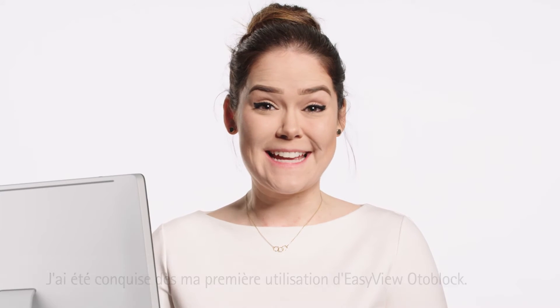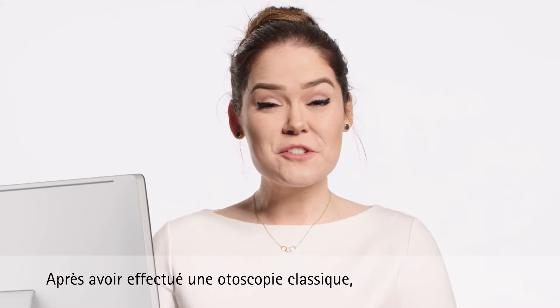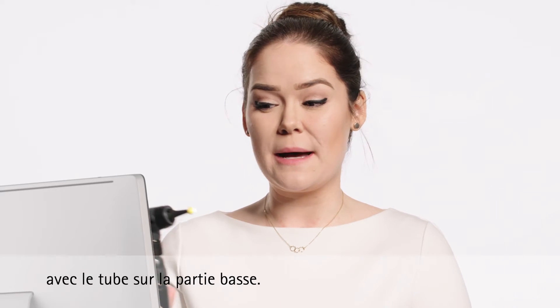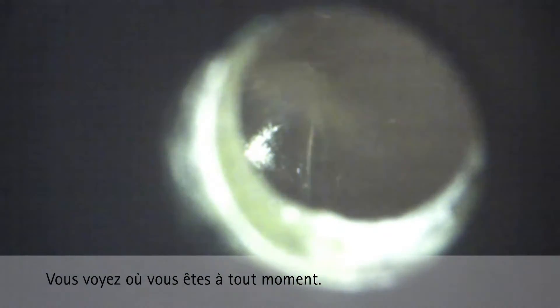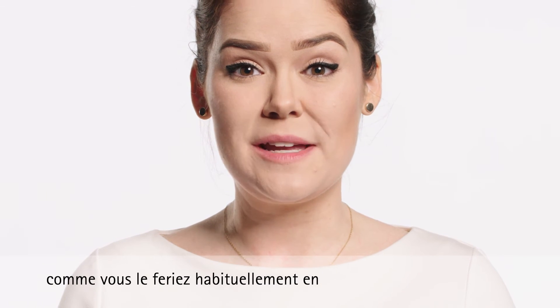The first time I used the EasyView Otoblock I was delighted — it's so simple. I can show you on my own ear. After conducting normal otoscopy, you place the EasyView Otoblock onto the specula with the tube along the bottom. Once it's on, you guide it all the way down the canal with a full view of where you are the entire time. At this point you proceed with the impression as you normally would by inserting the impression material.